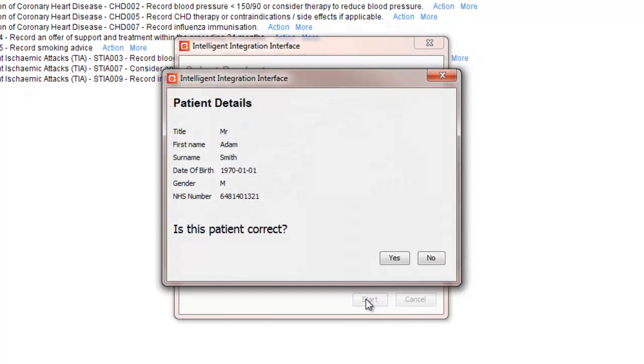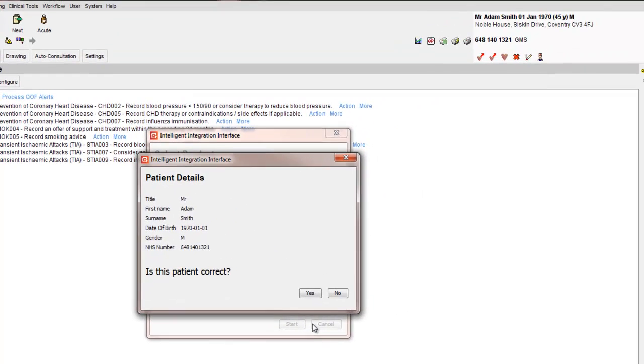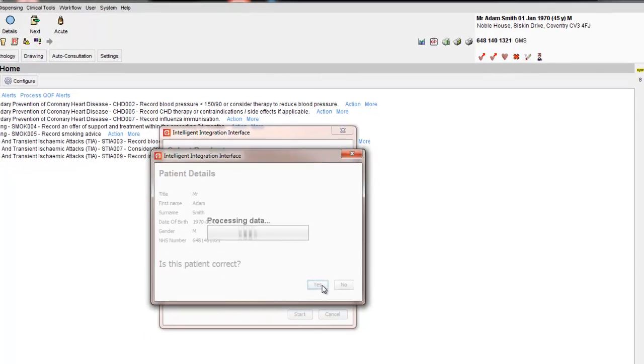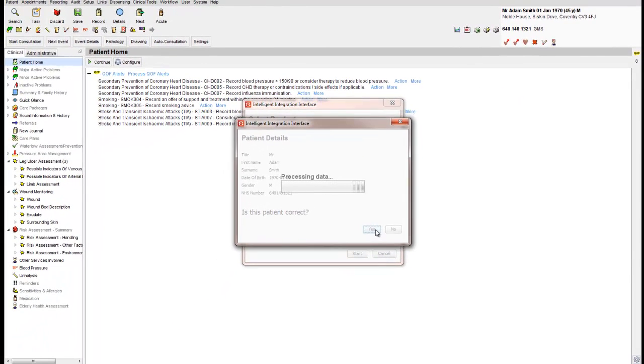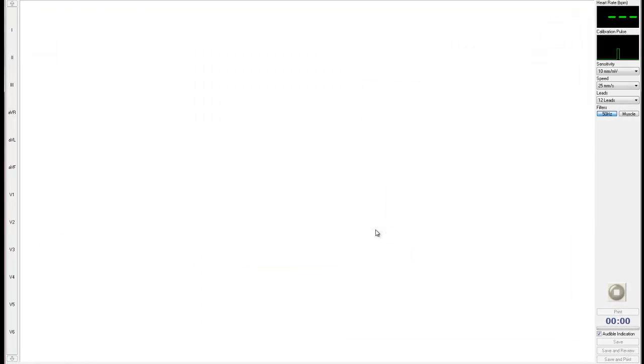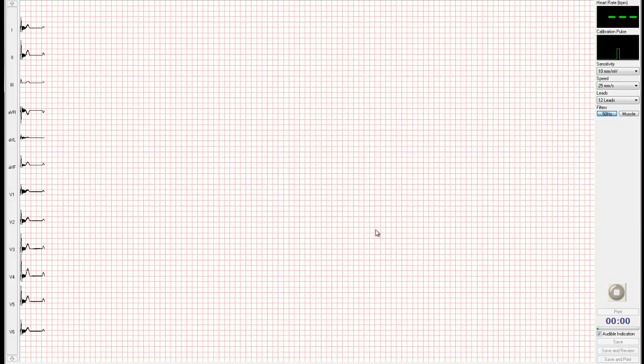I3 will now connect to System 1 and pull through the active patient's details. Confirm these details are correct by clicking Yes. These details will then be sent to the Universal ECG system, and the CardioView ECG software will launch.